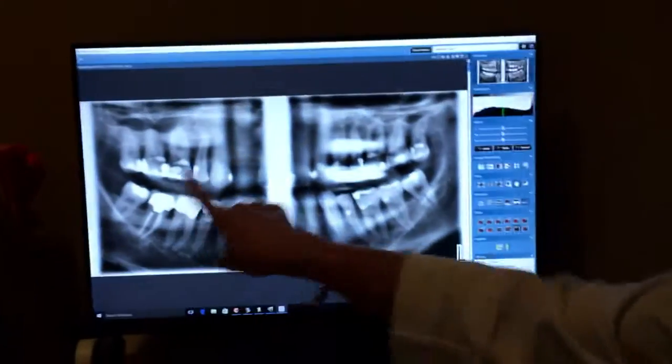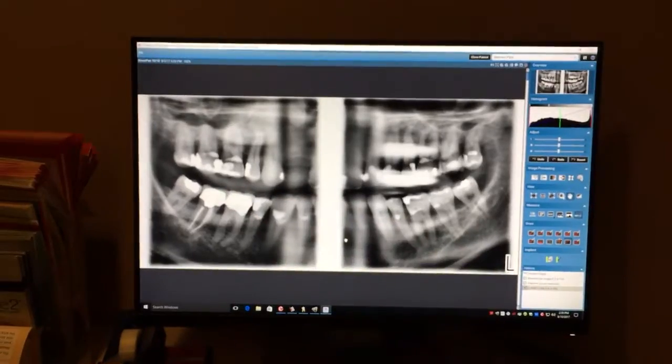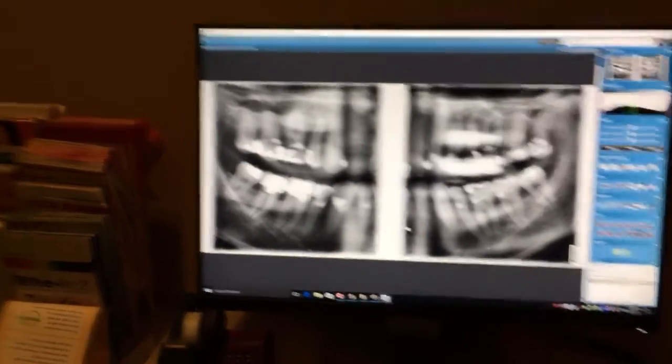It's something we're going to address through positioning. Whatever appears in one quad will always show in the opposite quad. Is there a way to clean up the artifacts? Not on the 2D — we just need to position it correctly.